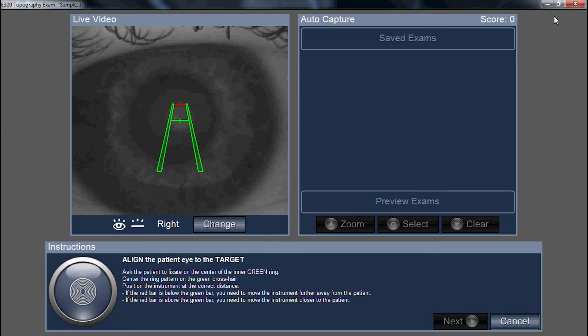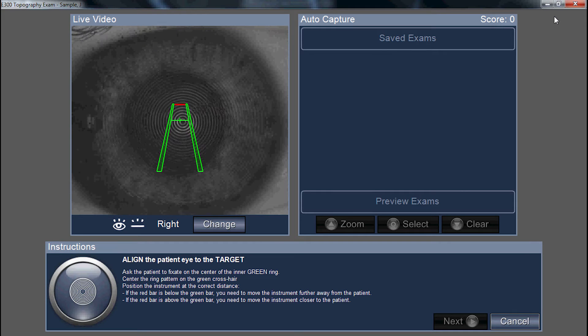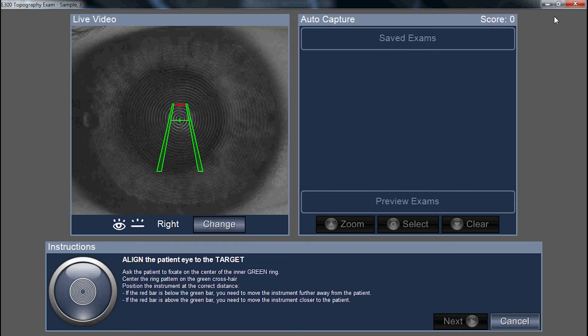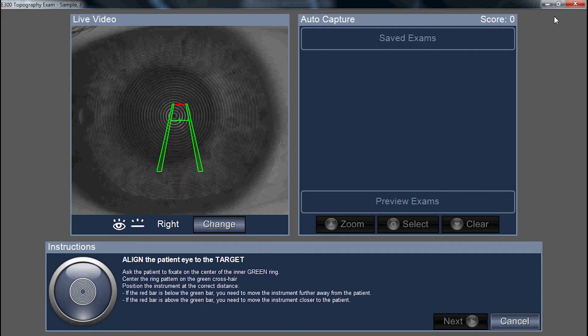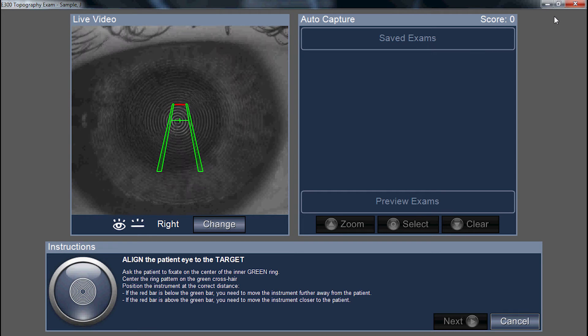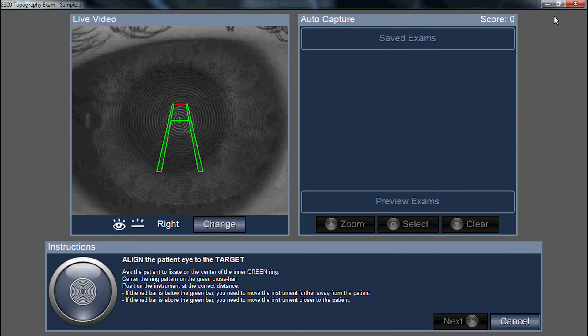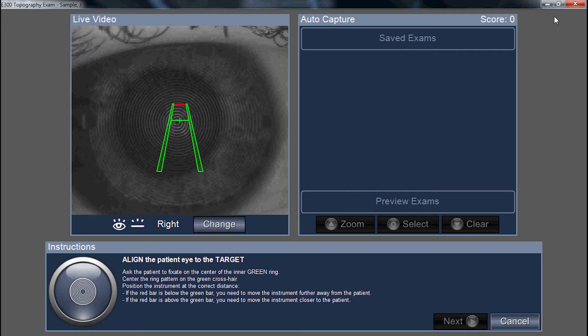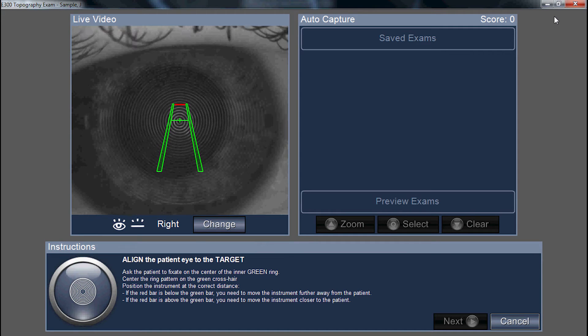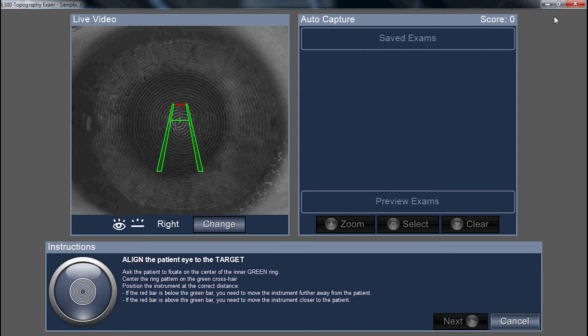If the rings aren't clear or visible, move the instrument forward until you can see the reflection of the Placido image. With the green crosshair centered on the apex ring, you're aligning the instrument to the visual axis, assuming the patient is looking down the axis of the instrument.